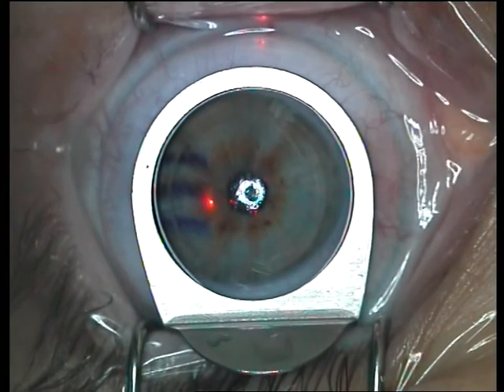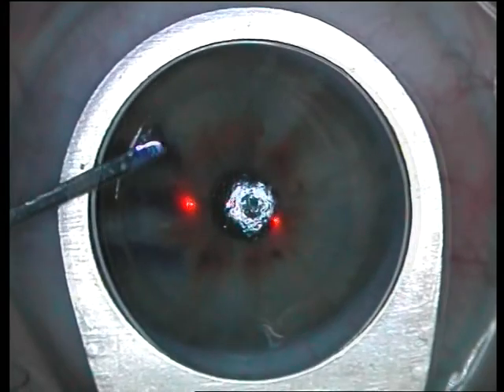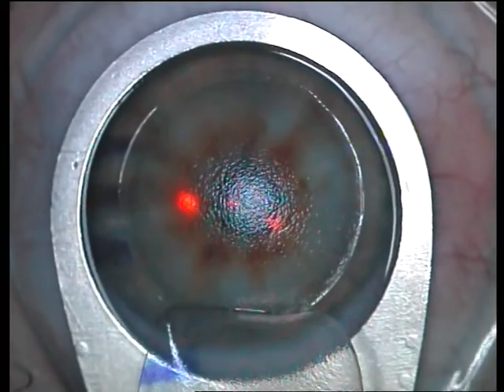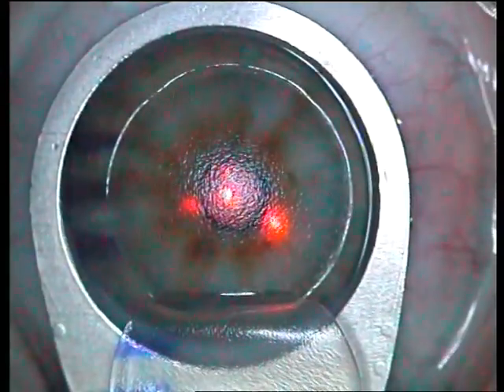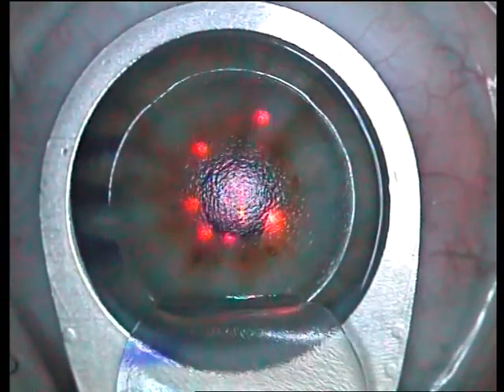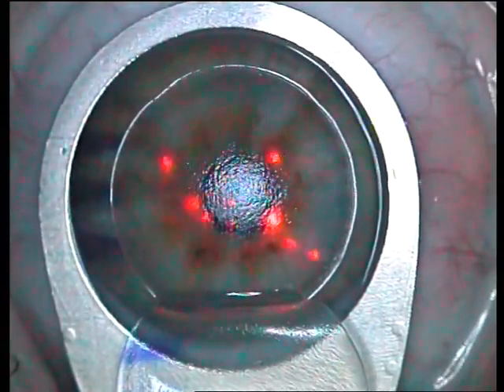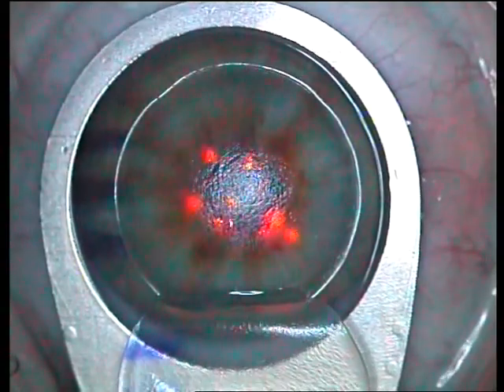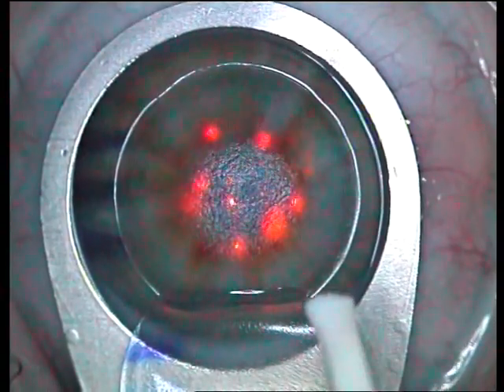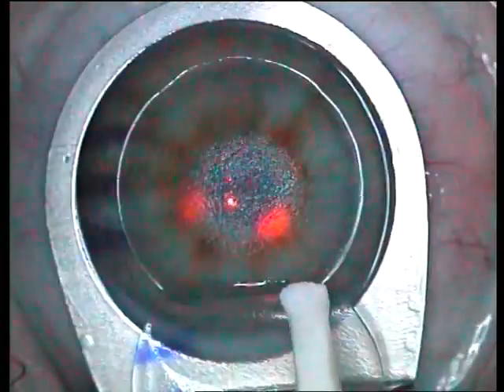Flap rest placed on the eye, laser aligned. The flap is reflected off the bed and onto the platform of the flap rest, away from any contaminant on the surface of the eye. The laser is started and the patient is asked to look into the center of the red glow. Constant encouragement is given to the patient during this step — such encouraging comments give them a great degree of comfort during the procedure.